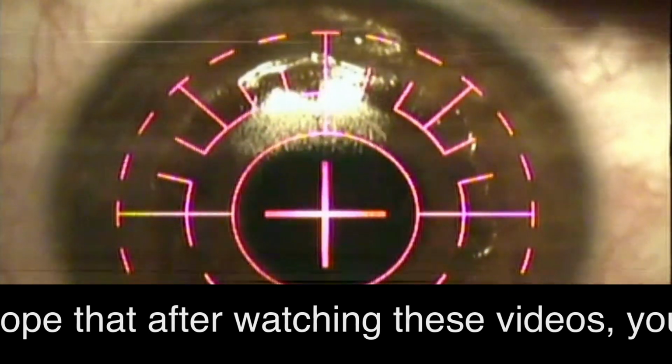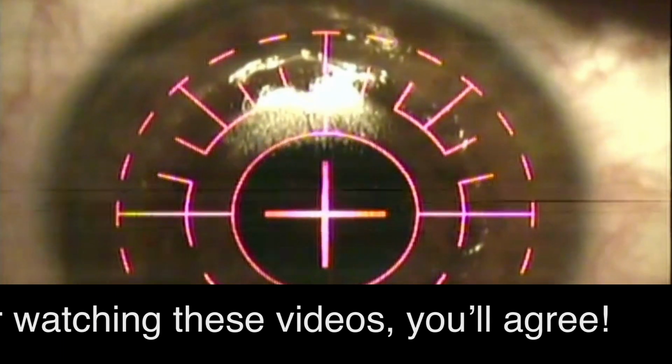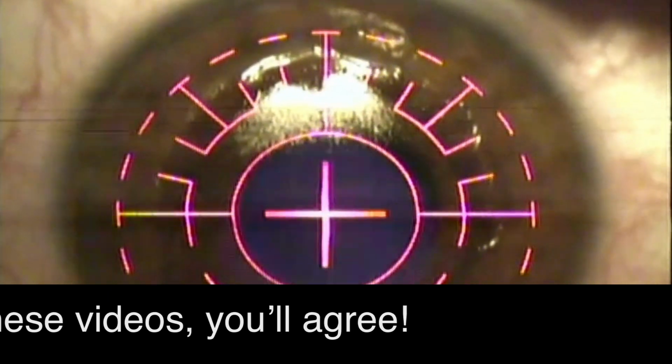It's a photoablative process that was invented at Columbia, when I was actually at medical school there, by Stephen Trokel and Francis L'Esperance. They're the two doctors who invented the excimer laser, and they're actually the doctors who trained me and certified me on the laser. This is almost 30 years ago. Okay, that's pretty much it.